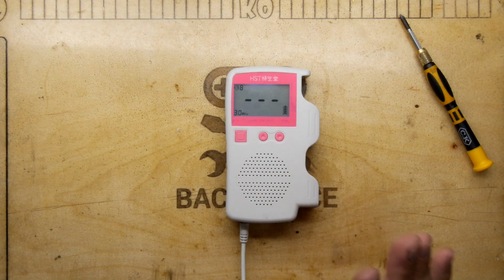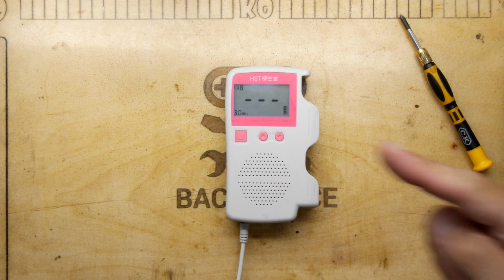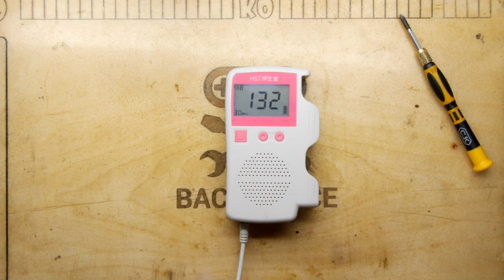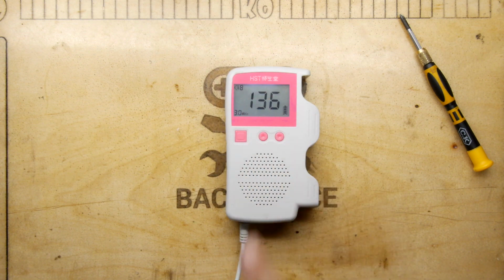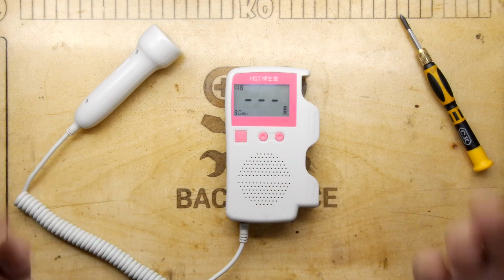So here's an interesting example. It's held up to my chest, right? If I move it around, I can create a bit of noise. So it sounds a bit like a normal microphone. However, what I'm going to do now is prod my, I guess, right side of my man boob, like my man nipple, and listen what happens when I flex my skin. You hear that? Now I can assure you that's not really making a sound that I could hear audibly. I'm literally just pressing my skin, but as I press it, you can hear it. So it's clearly affecting the sound path through your skin somehow, and that's how it's picking up stuff.